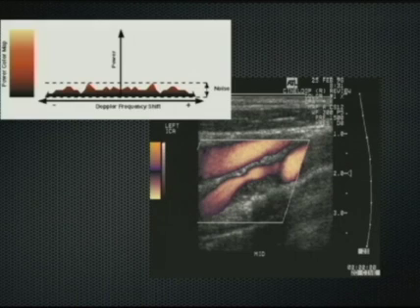Now, what about power Doppler? A couple of brief comments about power Doppler. With color Doppler, when we turn the gain up too high, we detect and display noise. And with a color Doppler map, the noise appears at all the colors in the frequency map. With power Doppler, we look at the amplitude of the Doppler information rather than the frequency. Because noise tends to be very weak and low in amplitude, we can cause the noise to be displayed in the dark or invisible portion of the color map, and only the true Doppler signals to appear in the color portion of the map.